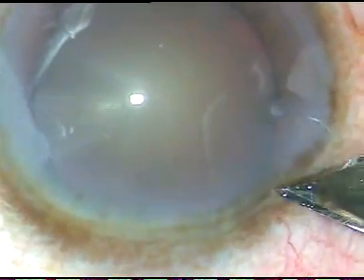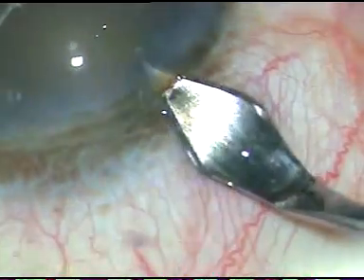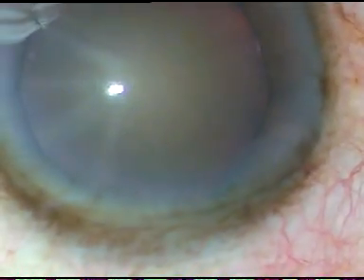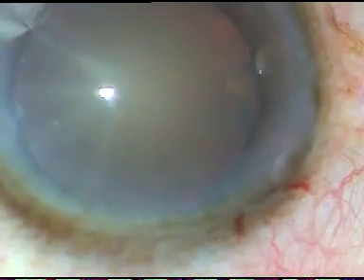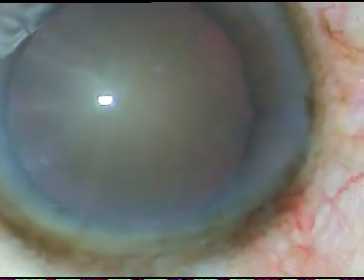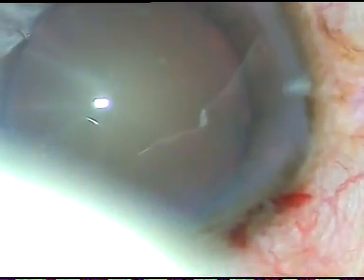Dear colleagues, this is how I do my free cataract surgeries. I do phacoemulsification for them because that is my routine technique and I feel more comfortable doing phaco than doing SICS.